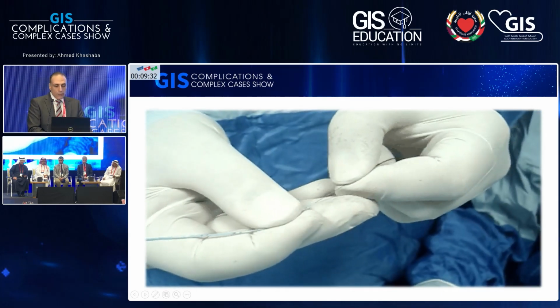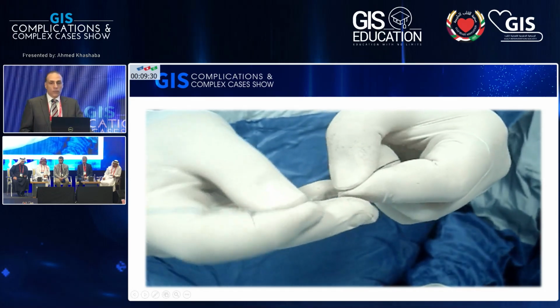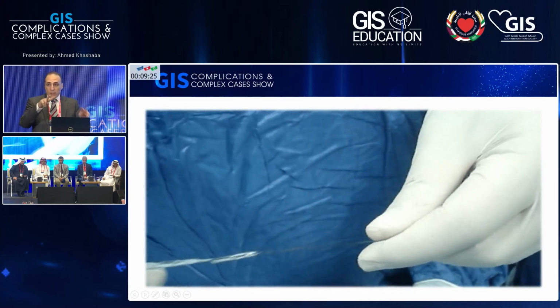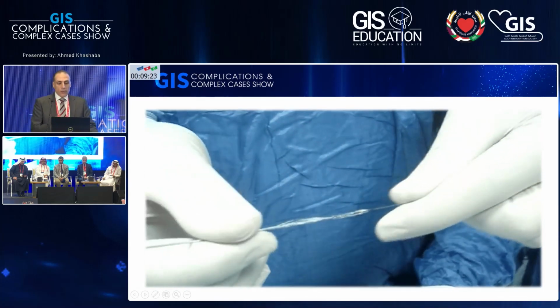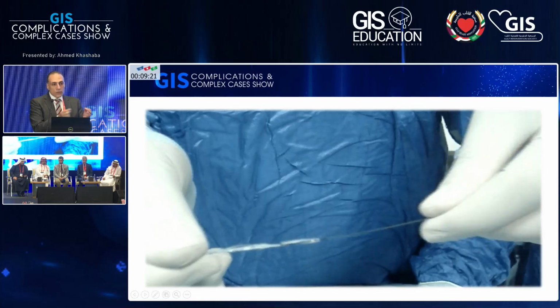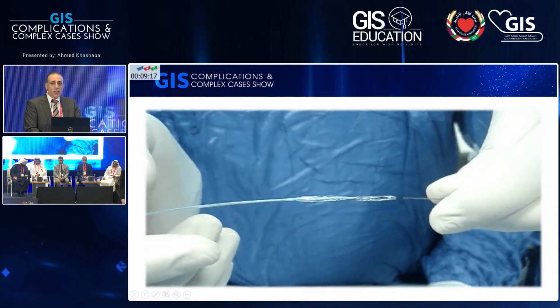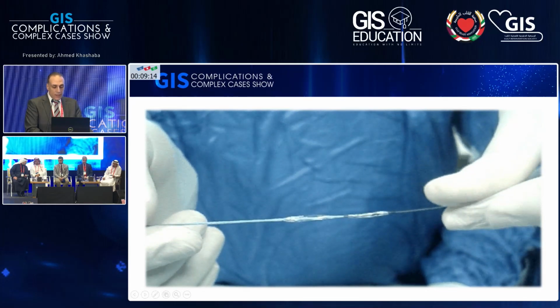And then you can push this with any other thing, maybe other balloon, because then you have one marker from the initial balloon and two markers. So you have three markers. You can see it on the screen, and you can push the half balloon to the distal artery. It's very cheap, very handy. You have this in every cath lab.